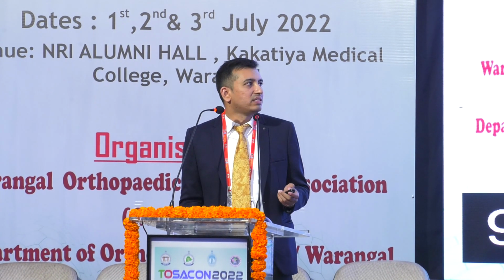Also, fall on an outstretched hand is a very common injury. Only distal radius fractures are commonly diagnosed, but other complex fractures or scaphoid fractures are often missed. So if we see, there can sometimes be inadequate or improper views which can conceal our diagnosis.